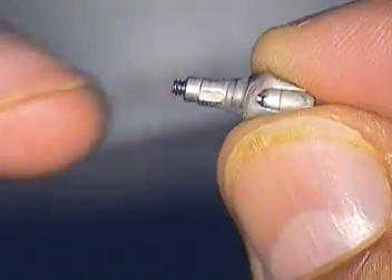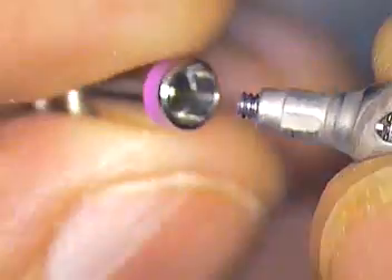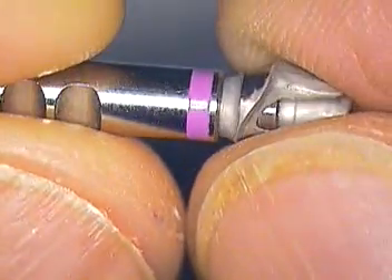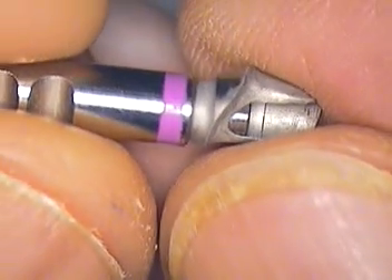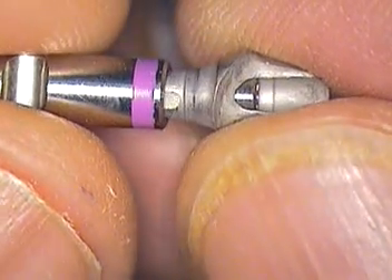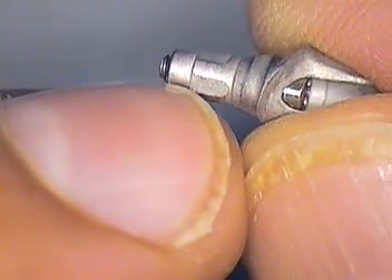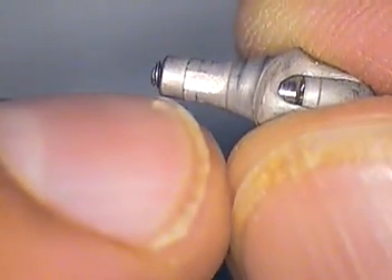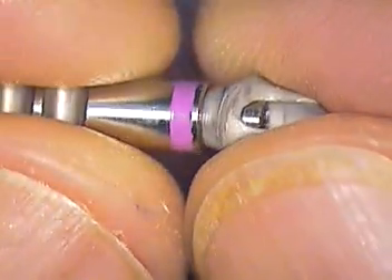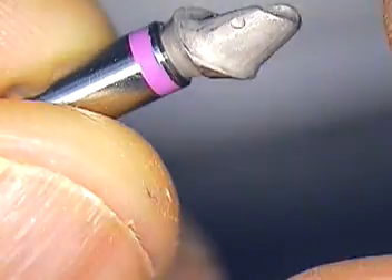Number one: if your lab sandblasts, you want to make sure that they put the analog on first before they do any heavy sandblasting. The problem is that the sandblasting is going to go below the level of the implant and get into the designated milled surfaces that you really don't want to have to go back in and polish again. And now that they're sandblasting, there's really nothing we can do at this point.